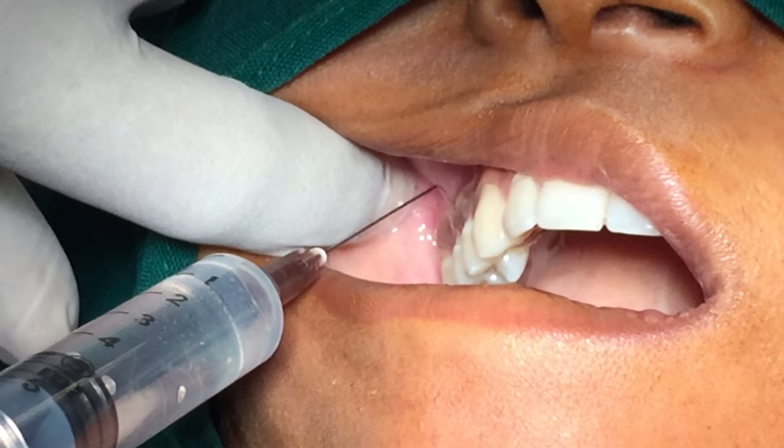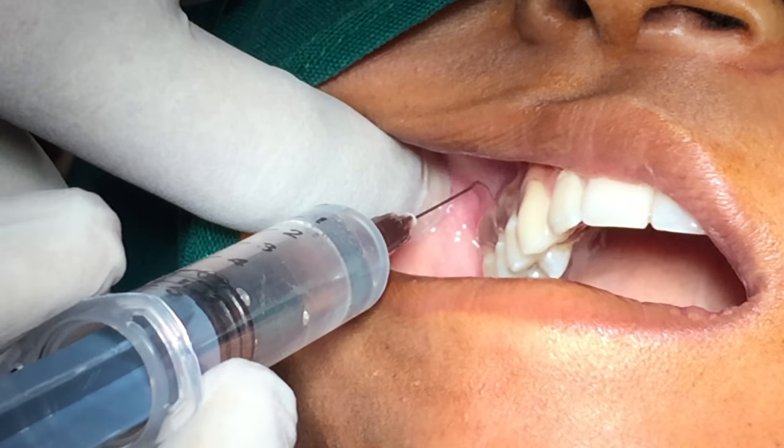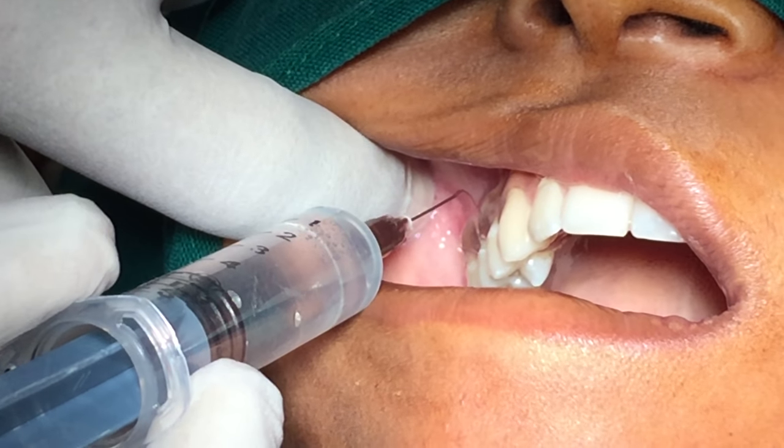Insert the needle into the height of the mucobuccal fold over the second molar and advance the needle slowly in an upward, inward, and backward direction.